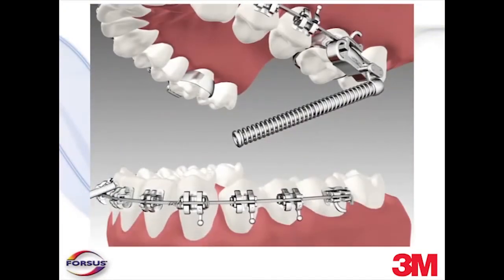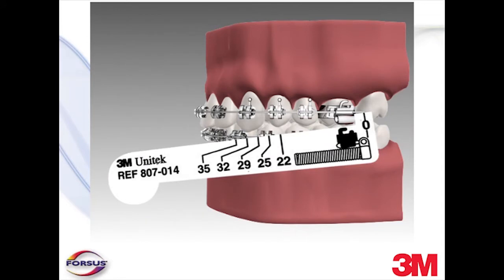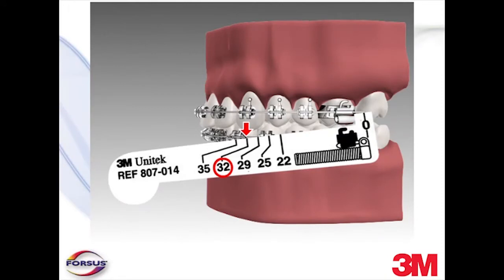The objective is to select a pushrod length that deflects the spring enough to exert force, but does not completely compress the spring when engaged. To measure the correct pushrod size with the jaw in centric position, place the distal end of the measuring gauge distal to the headgear tube, and the mesial end of the gauge where the pushrod will be placed on the lower arch, such as against the lower cuspid bracket or the lower first bicuspid bracket, or optionally against a Gurren lock placed distal to the bracket on the arch wire. The appropriate size of pushrod is indicated on the measuring gauge. Note that the pushrods are in a left and right configuration and should be measured separately. If the measurement falls between two values on the gauge, select the shorter length as the initial pushrod.